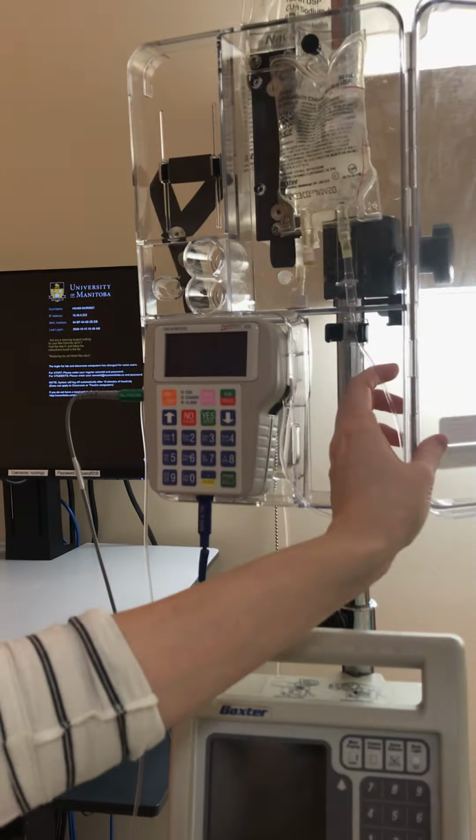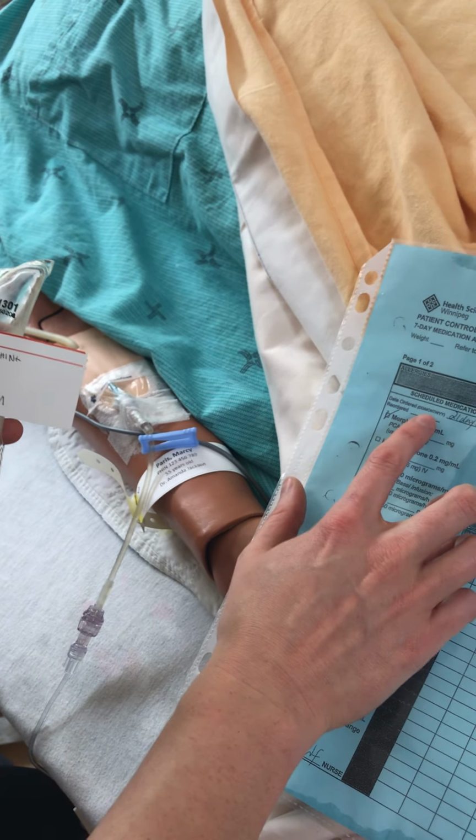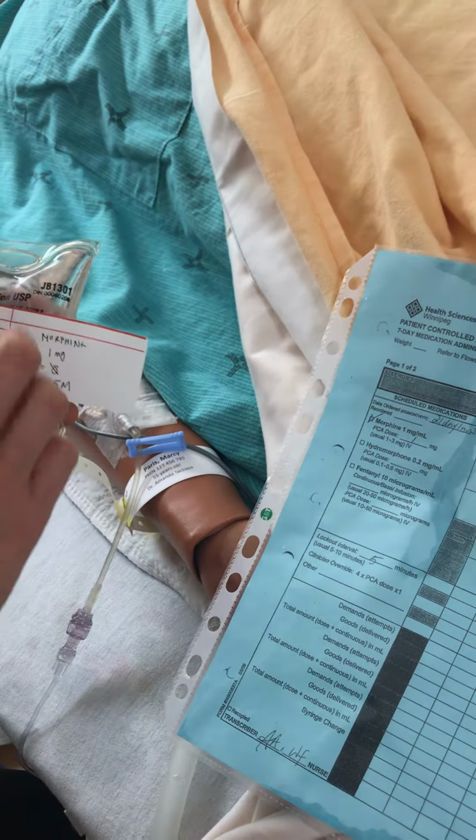So I've got the right patient, Marcy Paris. She's identified herself. The right drug, I've got morphine 1 milligram per milliliter. It's a bolus of 1 milligram. That's the right drug, also the right dose. The right route is IV. I've got the IV pump here for the PCA, and the right time is now. So I'm ready to set this up at this point.